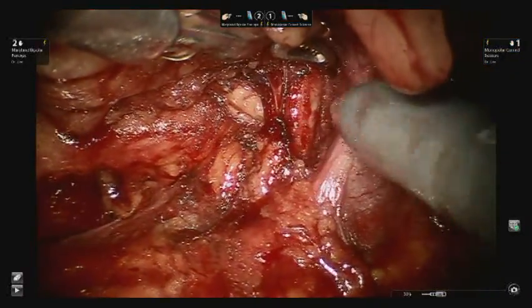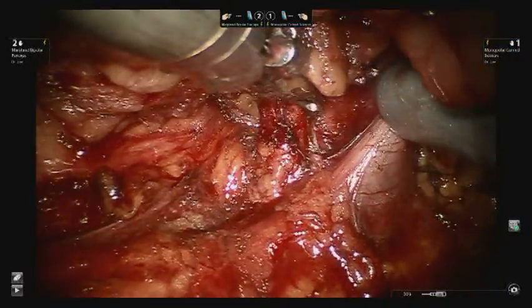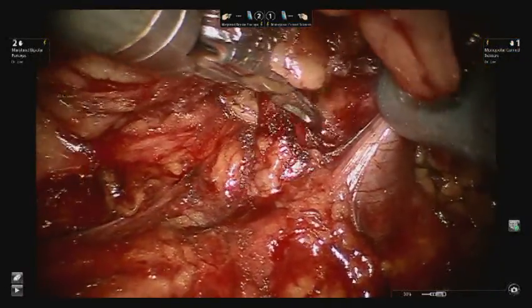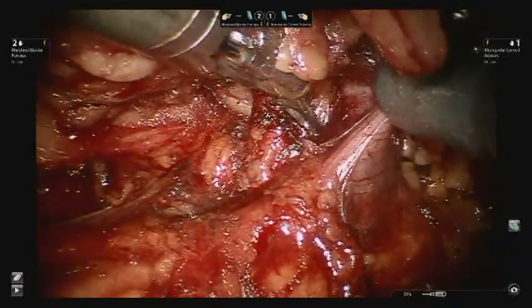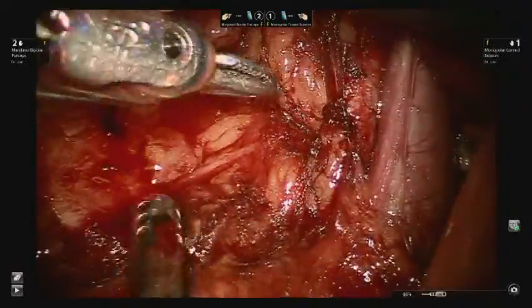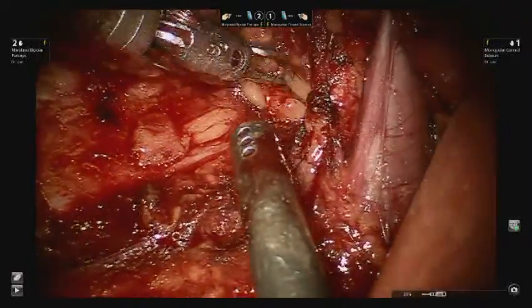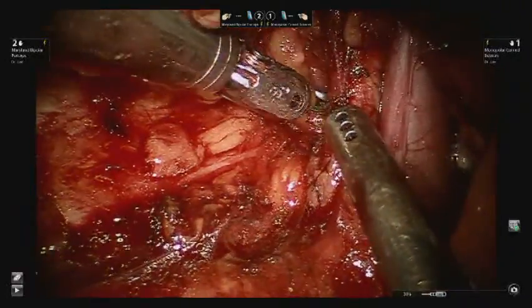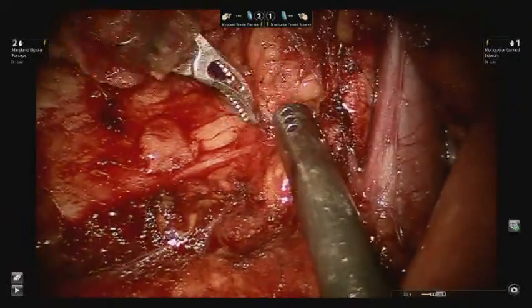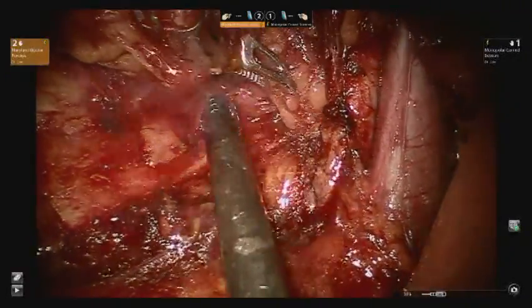Sufficient length is achieved with the artery to accommodate two robotic bulldog clamps. The tissue posterior and lateral to the artery is also dissected to ensure good coaptation of the jaws of the bulldog clamps.